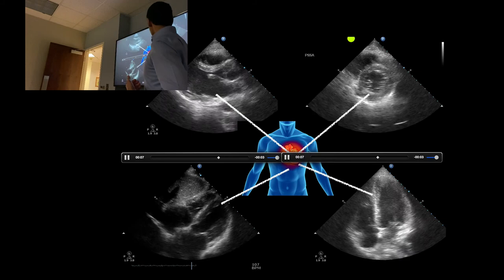Those are our four views. We're going to talk about how they help us answer basically three questions: Is there a pericardial effusion — yes or no? What is the LV function — good or bad? And what is the relative chamber size?